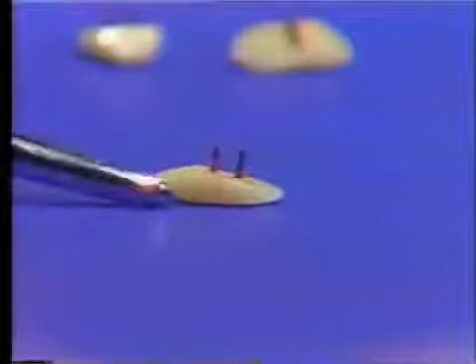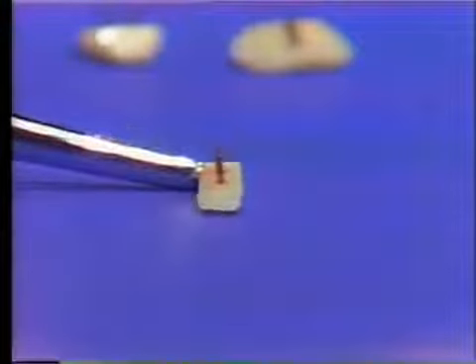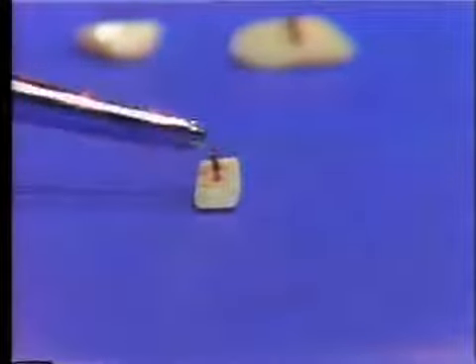Here is a long pin facing for a mandibular incisor tooth, and because the mandibular incisor is a long, narrow tooth, the direction of the pins is reversed, and they're placed one above the other instead of one on this side and one on the other. So just a little difference in the mandibular incisors in that form.